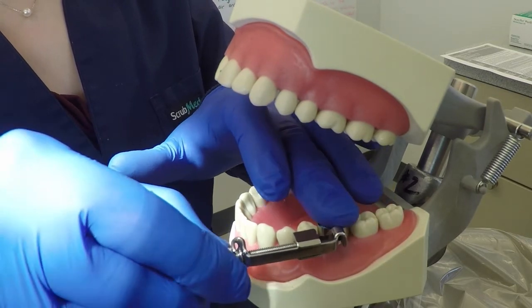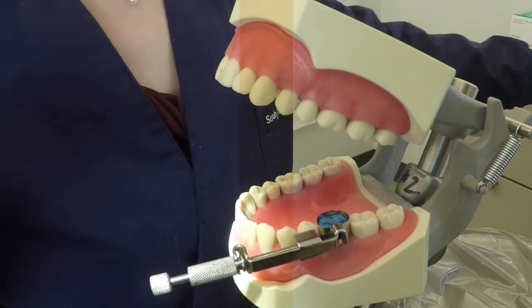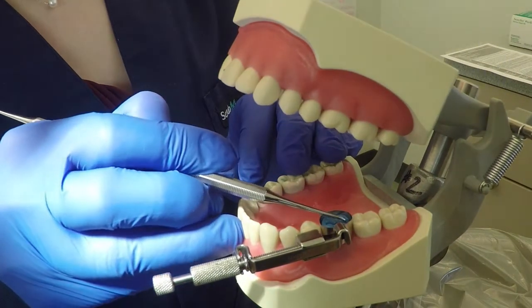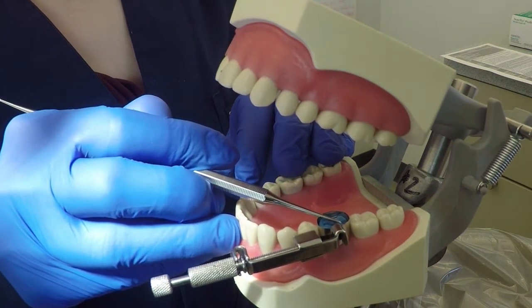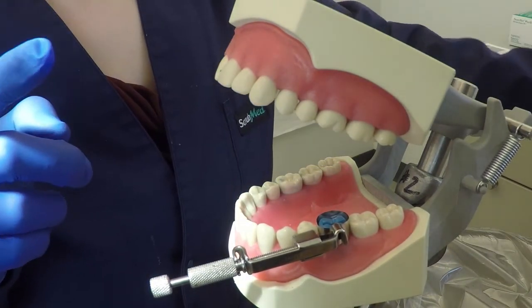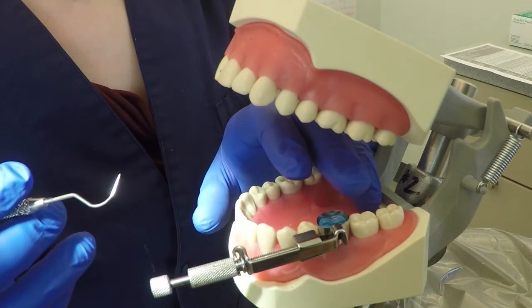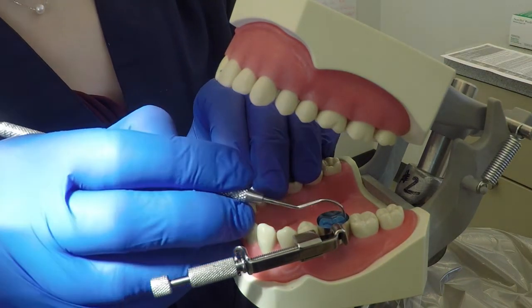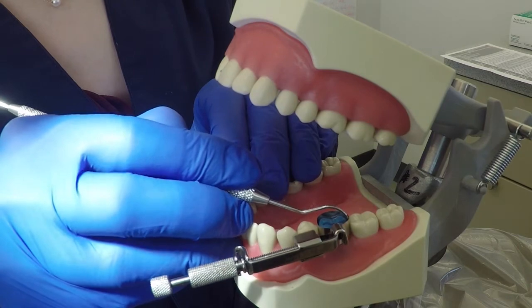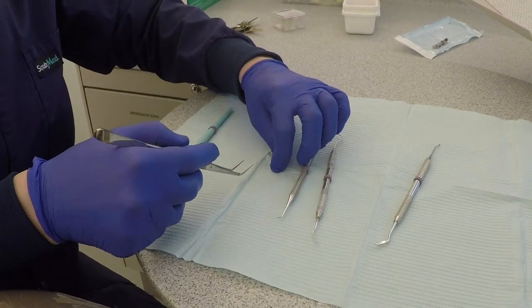Notice that the outer knob should be around the patient's lips. Now that the band is placed, use a ball burnisher to burnish the band against the adjacent tooth. Once the band is seated, there should be about a millimeter above the marginal ridge of the adjacent teeth. Now that the retainer and band have been placed, we are ready to place our wedges.